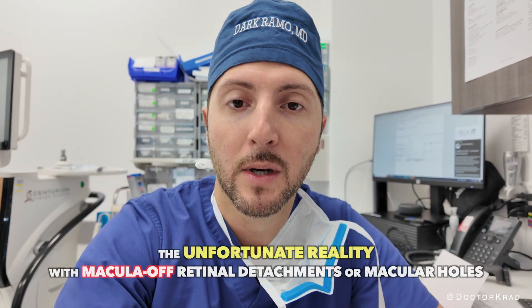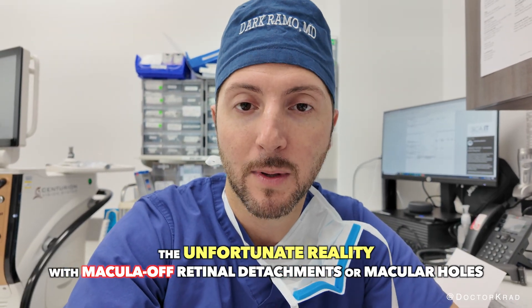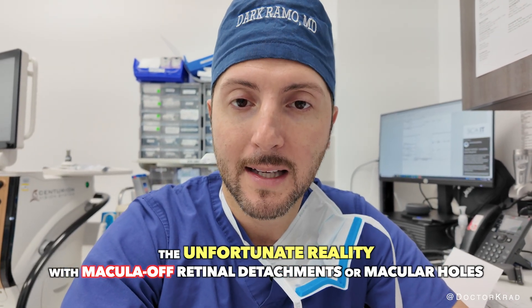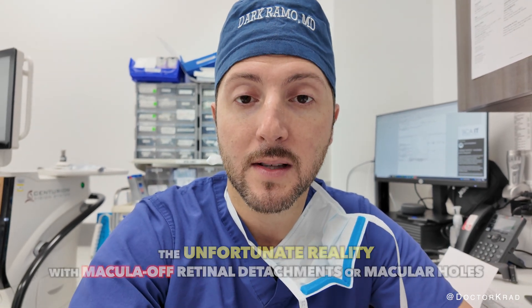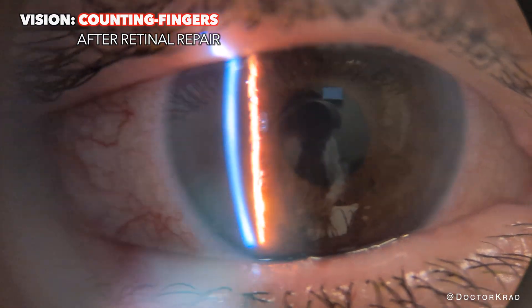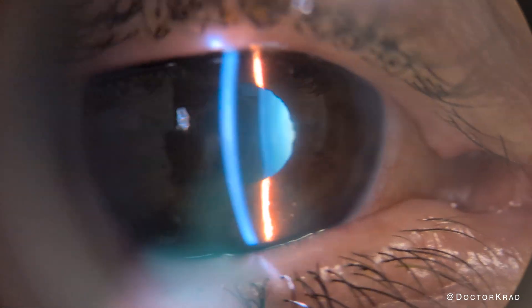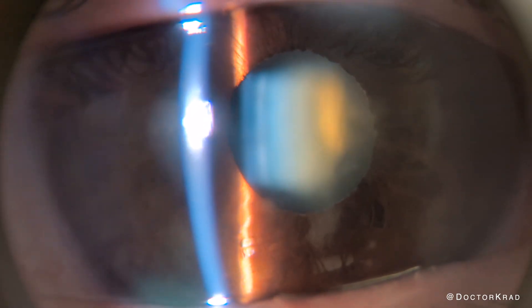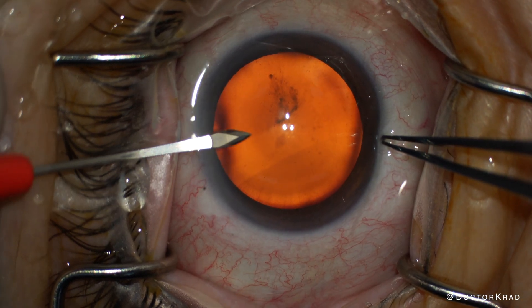It's very important that anytime you do surgery on a patient that had a MAC-OFF retinal detachment, you have to make sure that they have realistic expectations. Even with the best lens, they may notice some distortion in their vision. Here's the patient's cataract — there's dense nuclear sclerosis and a mostly non-reactive pupil. There's also some corneal punctate keratopathy and sub-epithelial opacification.